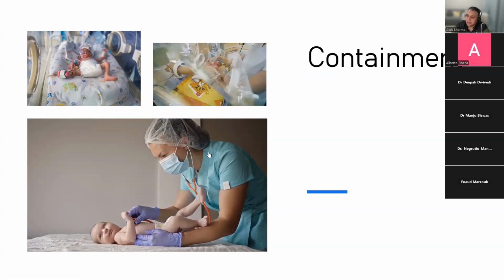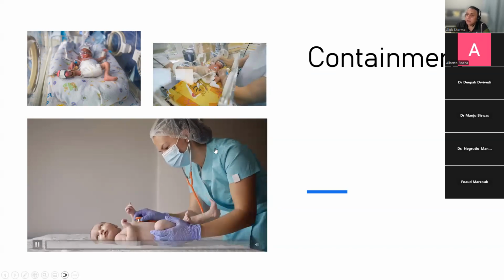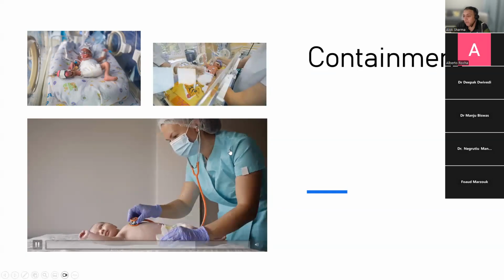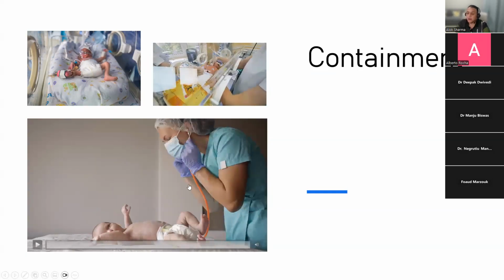So again, just a few things before containment. I will always examine my baby and decide where I'm going to place the probe before I do my scan. It's giving me clinical information. So a lot of my colleagues will sometimes say it's busy and we help each other.